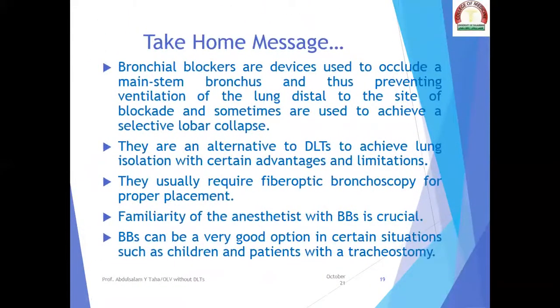As we have already mentioned, bronchial blockers are devices used to occlude a main stem bronchus and thus prevent ventilation of the lung distal to the site of blockade, and sometimes they are used to achieve a selective lobar collapse. They are an alternative to double lumen tubes to achieve lung isolation with certain advantages and limitations. They usually require fiber optic bronchoscopy for proper placement.